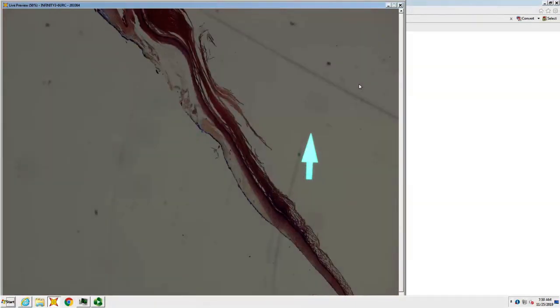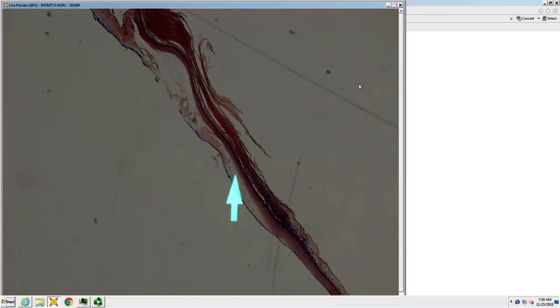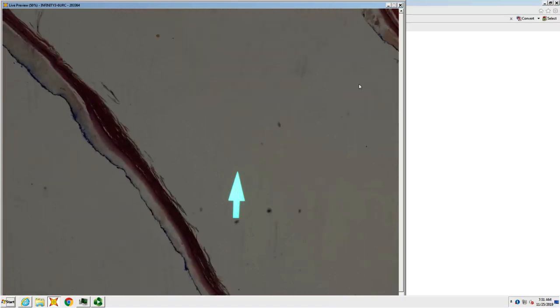So we've got a thin shave, got some hyperkeratosis. Can't really tell if that's just papillary dermal edema. Seems like it. Epidermis normal or not normal? It's very thin. So an atrophic epidermis with hyperkeratosis and papillary dermal edema, kind of smudged collagen. I don't really see a lymphocytic band, but I'm thinking of LS.